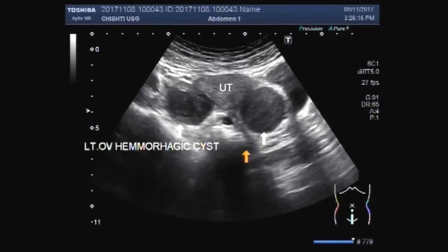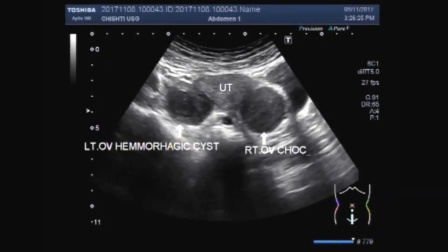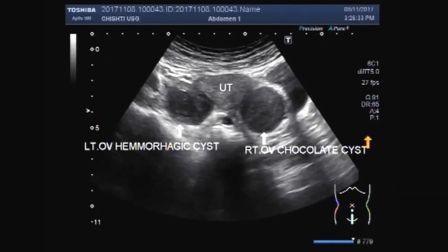Now this is the right ovarian chocolate cyst. This is the urinary bladder.